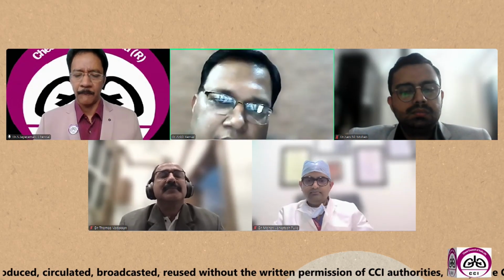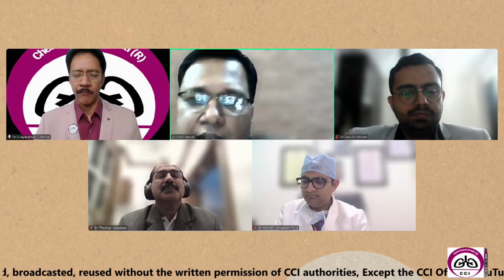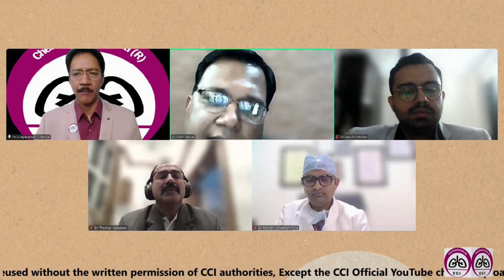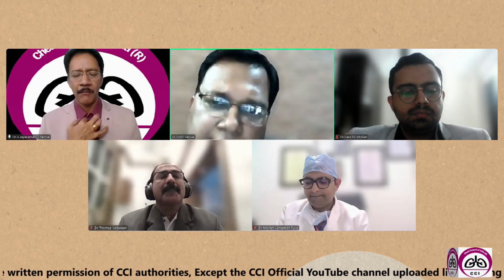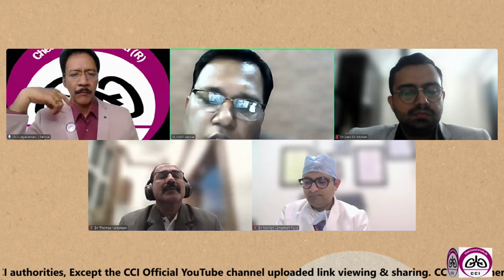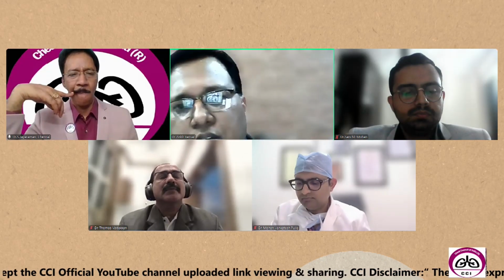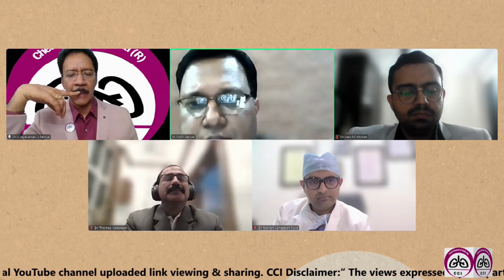So we can correlate the axial and sagittal views well. Importantly, it has a relatively high diagnostic yield because it is frequently involved in lung cancer, and it is large and accessible, so there is operator confidence in that case. So for beginners, definitely station 7 is the one that should be mastered first.